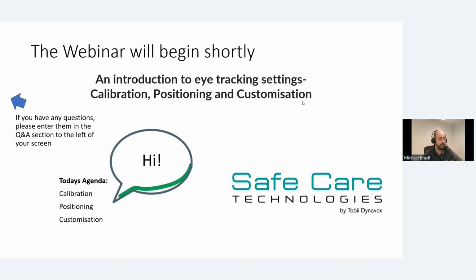Okay, so as I said, I can see a few new names on the list and a few familiar names as well. So I will go through it as best as I can for both audiences. Today the agenda is calibration, positioning, and customization of the eye tracking settings software. I'll go through the different areas, a bit of text on PowerPoint slides, and then I'll do a live demonstration on the iSeries for the eye tracking settings software.